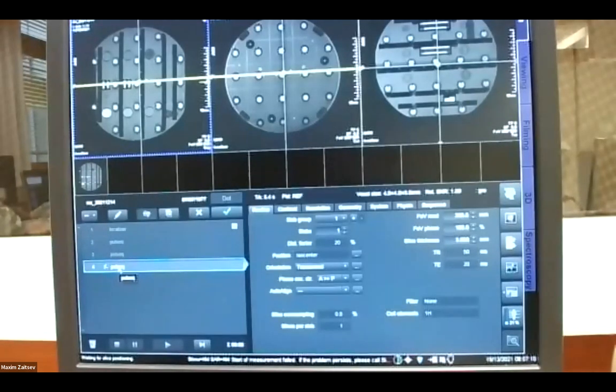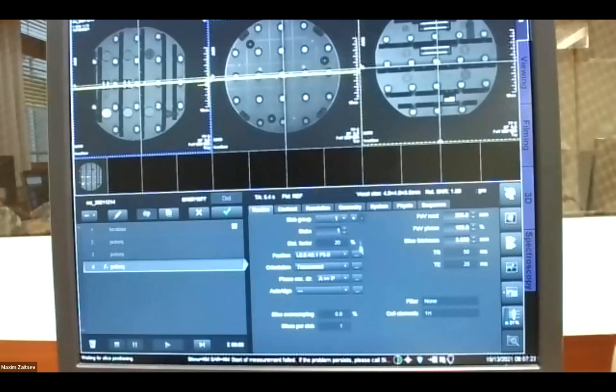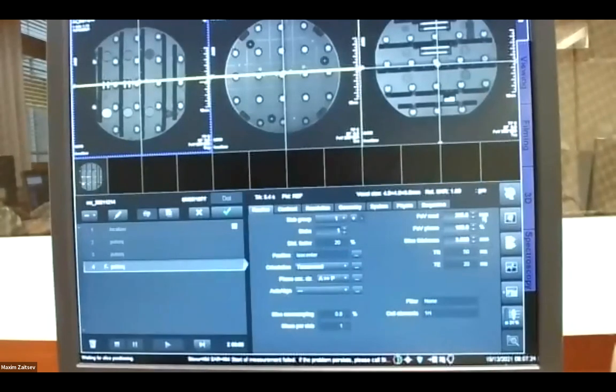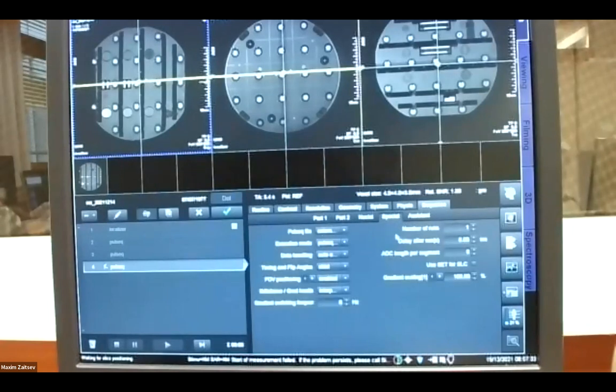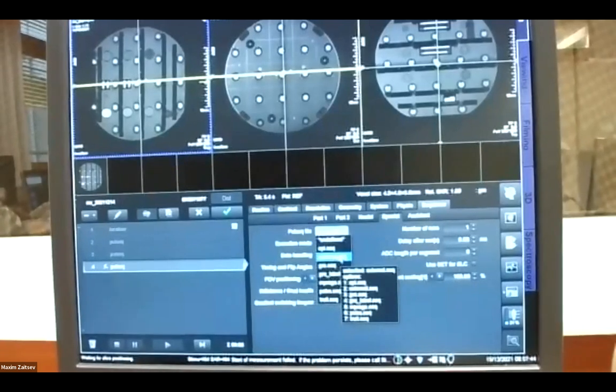So I'm cloning the last RAN protocol. I'm opening the protocol. So most of these parameters are not effective. They're not doing anything. But you can position your slices. I go back to the center for the example. You can change the basic orientation, or you can go to the sequence special. And this is really your home in the Pulseq world. You can, for example, select some of the pre-installed sequences, but we will use the external one because this one is automatically replaced in our demo.